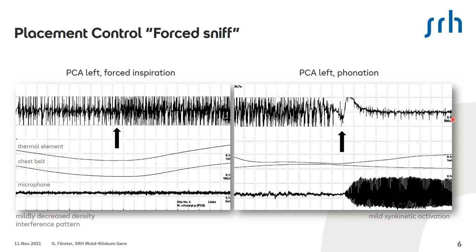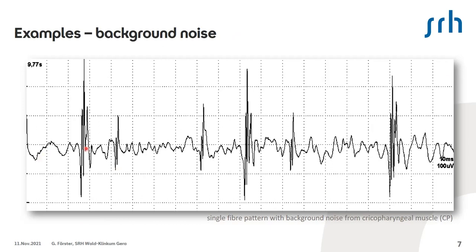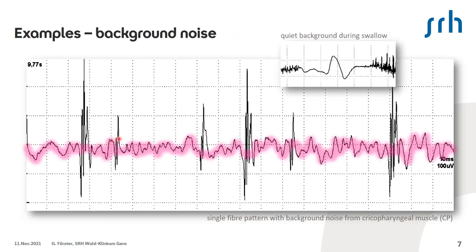How do you look for pathologic spontaneous activity in the PCA? Let's start the other way around. The background noise in the PCA is usually more than in the TA, because the pharyngeal constrictor muscle is very close by. So you always get some background noise from the constrictor pharyngeus. And if you make the patient swallow, this background noise you can actually see disappearing. Yeah. And that's how it actually smooths out during the swallow, which makes it sometimes easier to detect small signals.